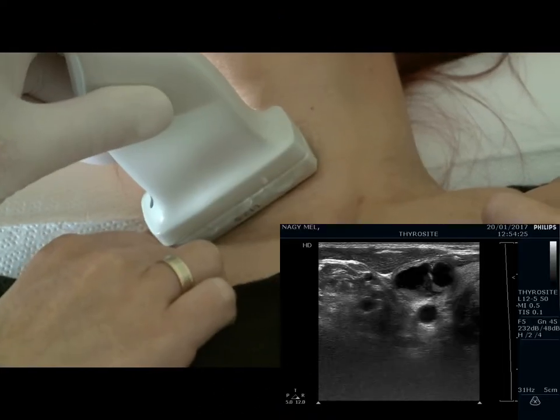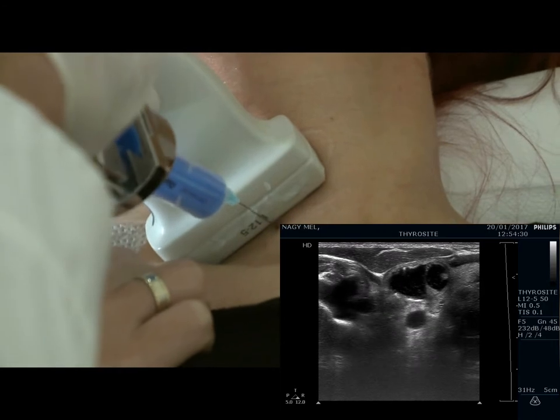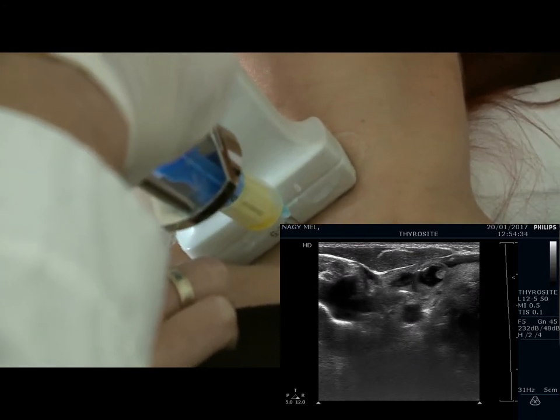The first technique of ultrasound guided aspiration is the perpendicular one. The nodule is positioned in the middle of the screen while the needle is positioned centrally just over the nodule. We aspirated 1.5 ml of yellow fluid.